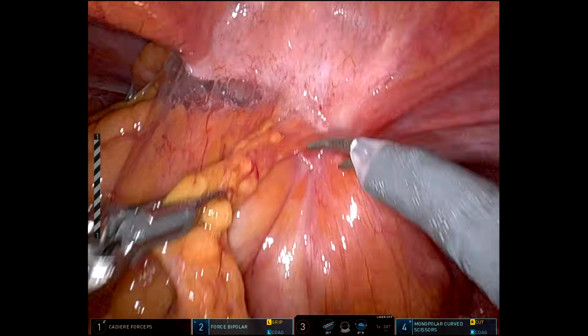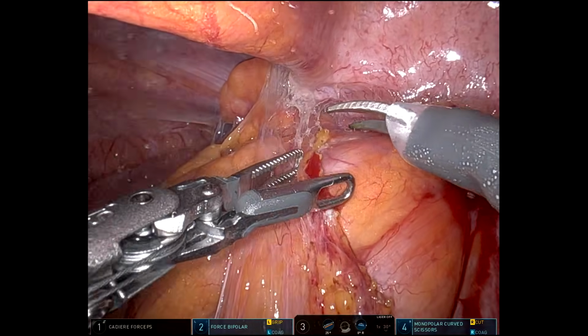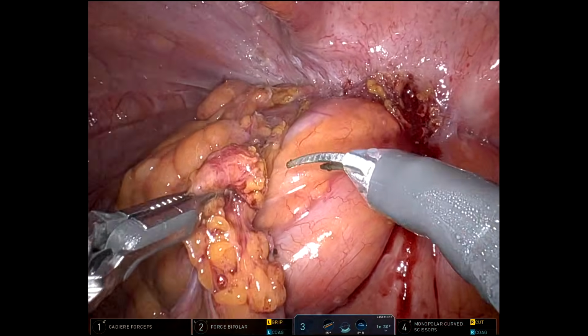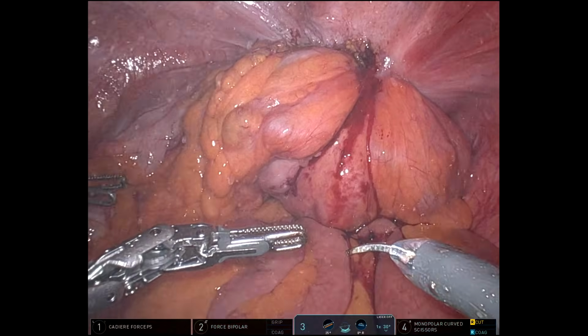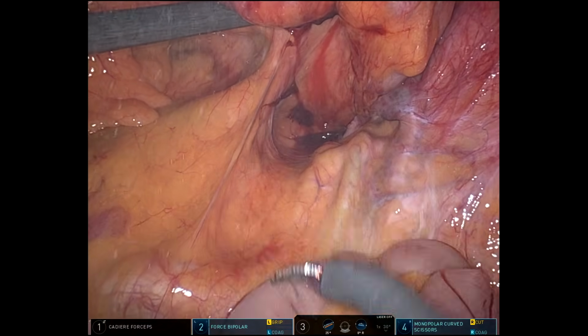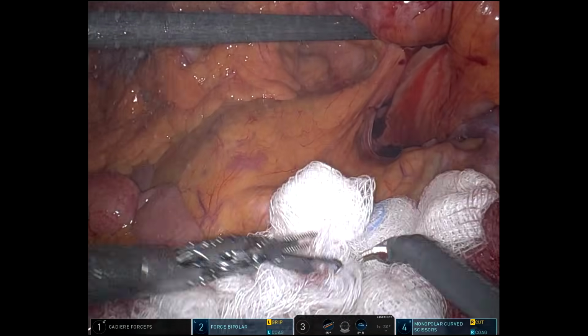Hello, I'm sharing a case of diverticulitis with a colovesicular fistula. This is an elderly individual who had had this for several months. Initially, the family was hoping to avoid surgery, but she continued to develop urosepsis, and we elected to do a resection. I'm just showing the steps.